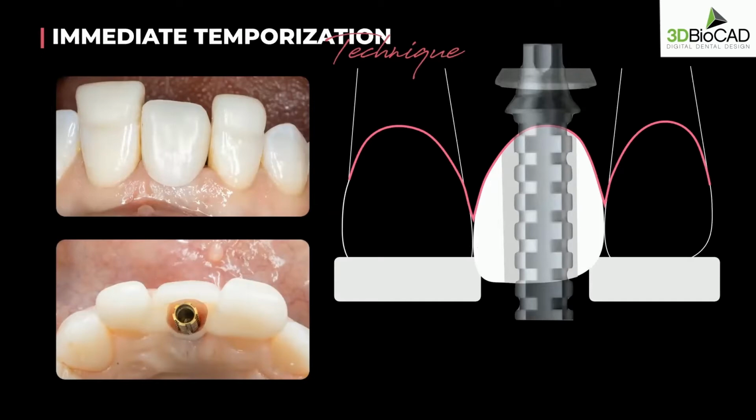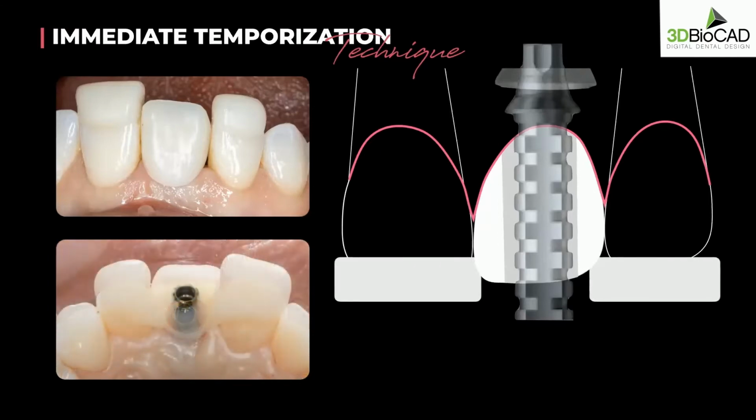And to adjust the temporary abutment, I don't like grinding it inside the mouth, just because then the metal particles will go everywhere and might contaminate the surgical site. So obviously we don't want to do that. So you end up adjusting it outside the mouth, which I think is quite hard to do. So I like to keep my life very, very simple, and I make the procedures very easy. So what I do is I adjust the temporary shell. So basically I adjust it until nothing's touching.